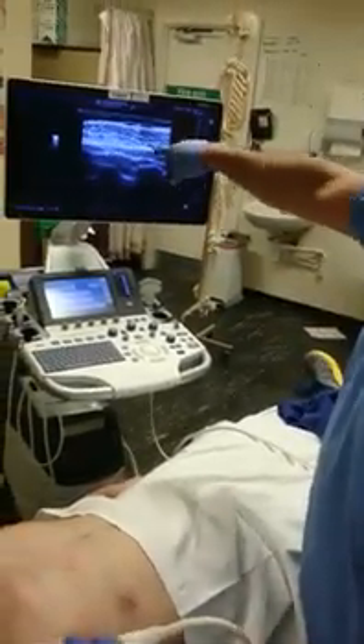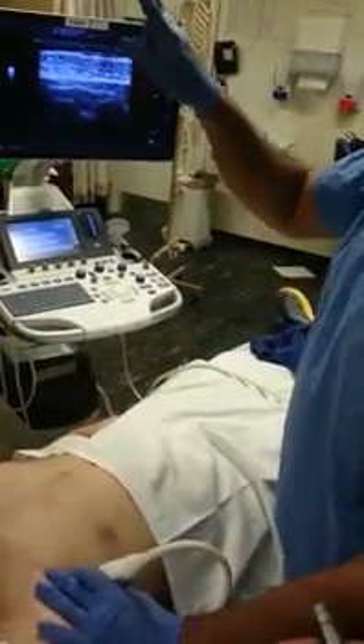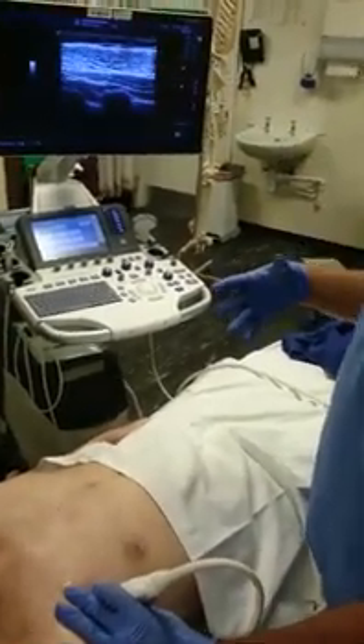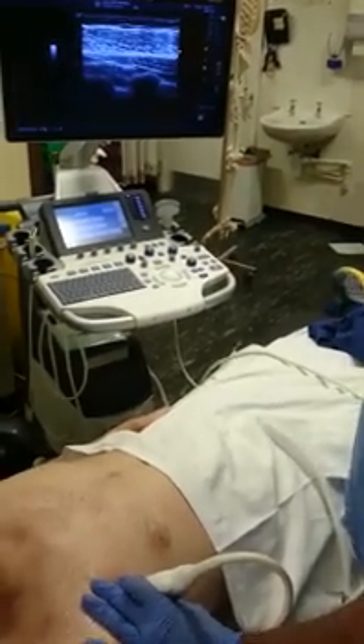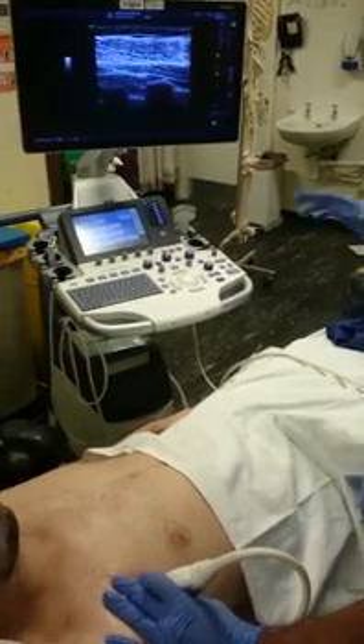You can just do that — the same like the TAP block where the transversus abdominis tapers off. It's the same block; this is a modified pec block. The classical pec block is just to do it between major and minor for one injection, and between minor and the serratus is your second injection.